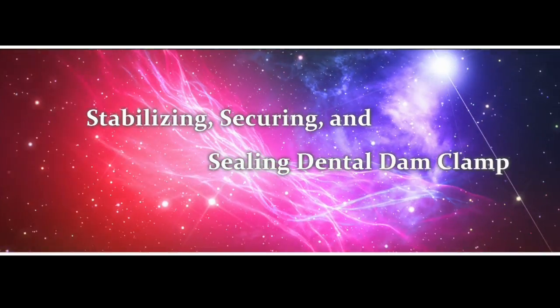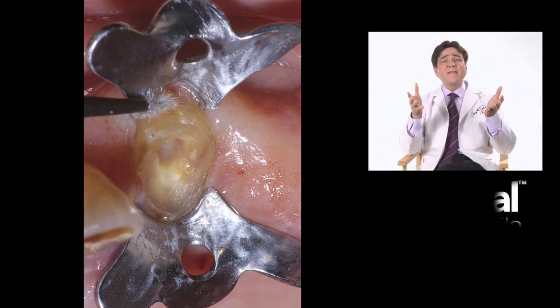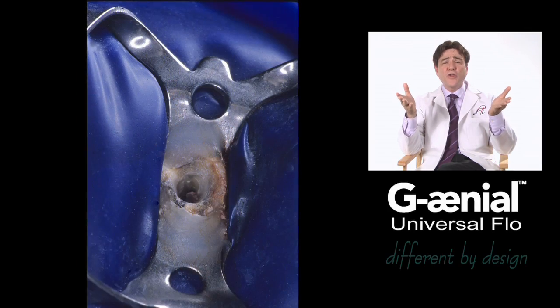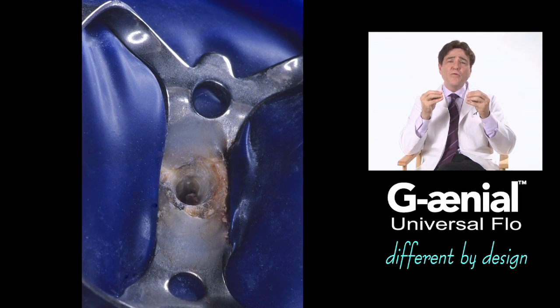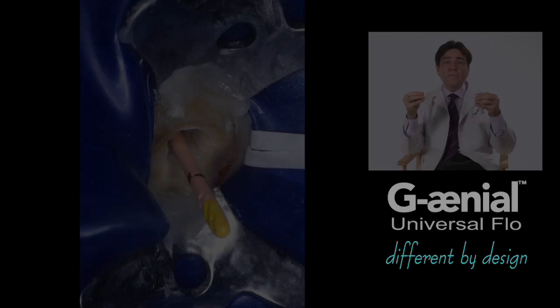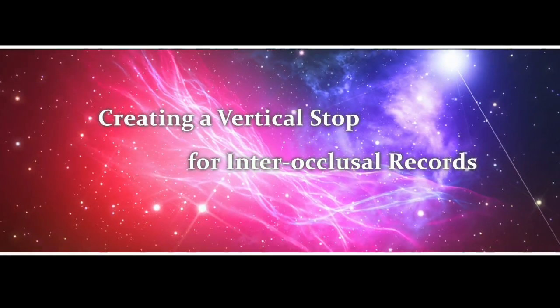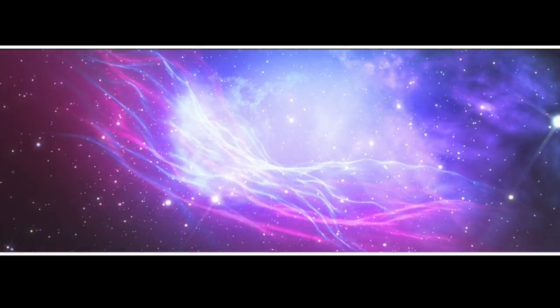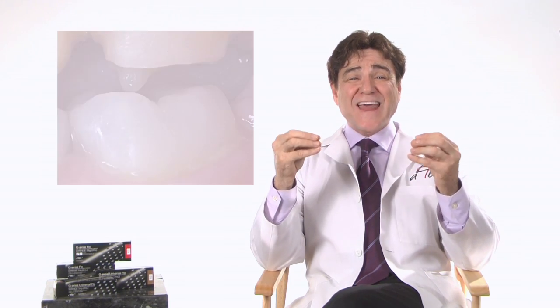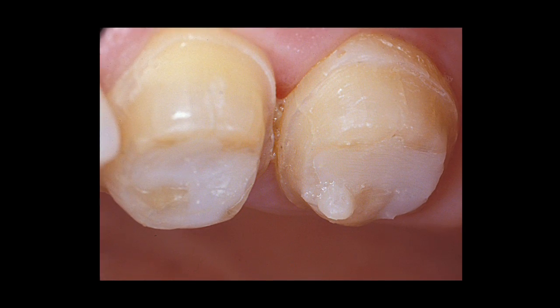Flowables can be used to stabilize, secure, and seal the dental dam clamp prior to procedure. Endodontic and adhesive procedures require proper isolation, and these flowable materials can be used to stabilize, secure, and seal the working field. Creating a vertical stop for interocclusal records: flowable composite resin can be used as an accurate interocclusal record for the orientation of models for fixed prosthetic restoration.